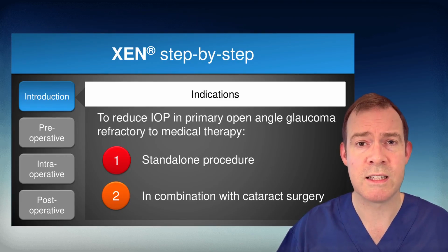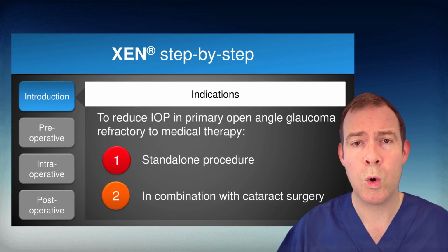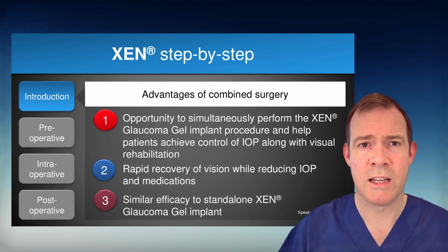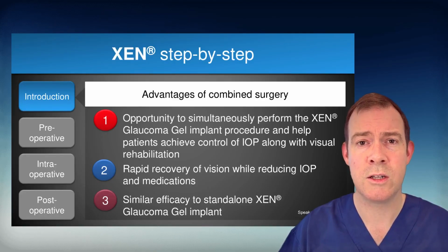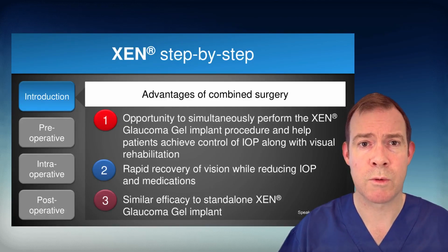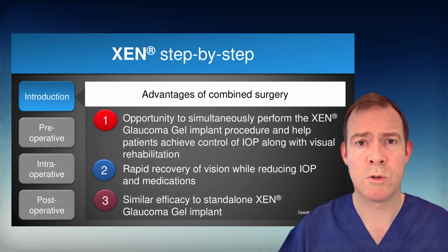It can be performed as a standalone procedure or in combination with cataract surgery. The advantage of combined surgery is it gives us an opportunity to not only reduce intraocular pressure and medication burden, but simultaneously perform visual rehabilitation by removal of the cataract. This provides patients with a rapid recovery of vision while helping to reduce their intraocular pressures and number of glaucoma medications. Studies show that combined surgery has similar efficacy to standalone XEN surgery.